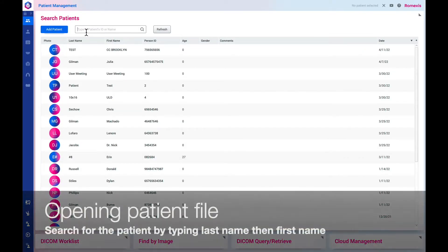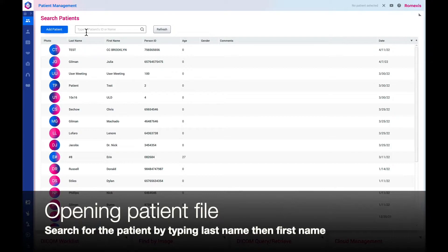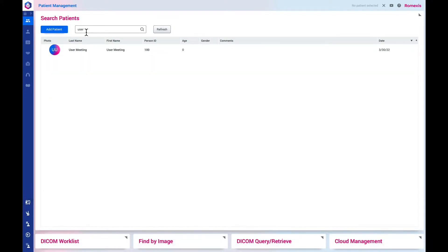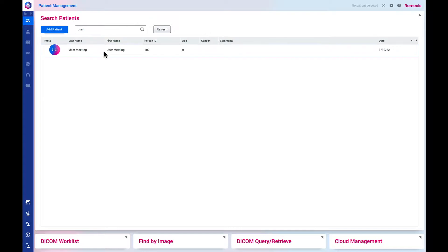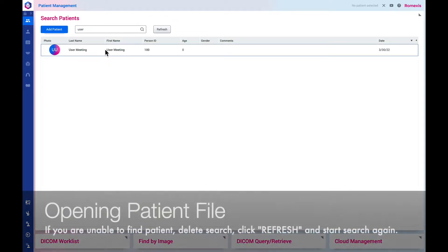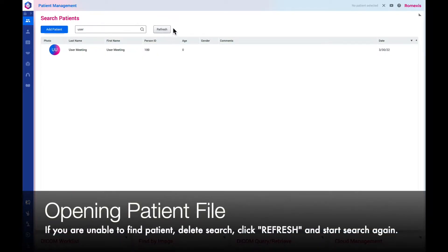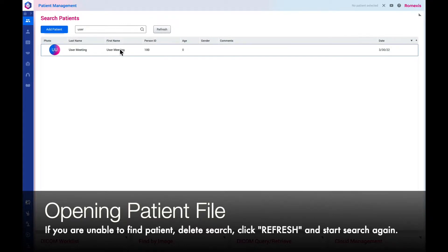To find a patient, type in their last name then their first name in the search bar. If you are unable to find the patient, delete the search, click refresh, and begin searching again.